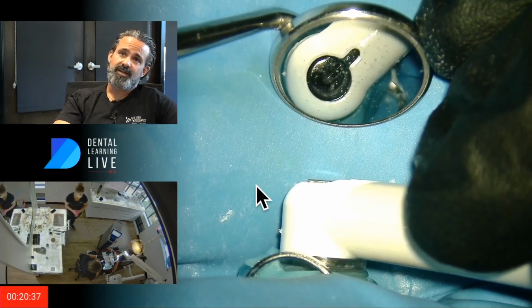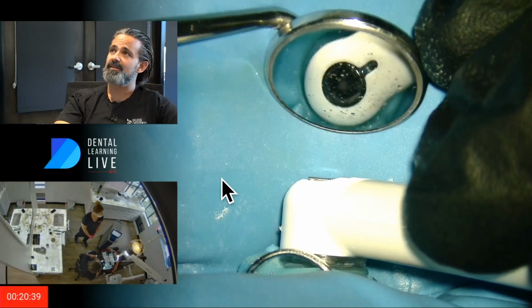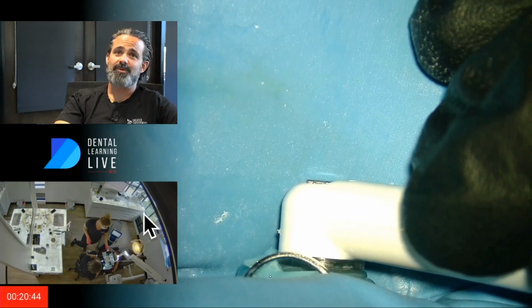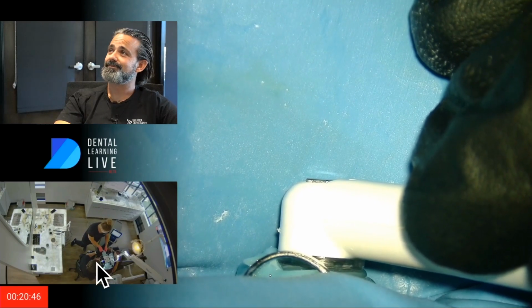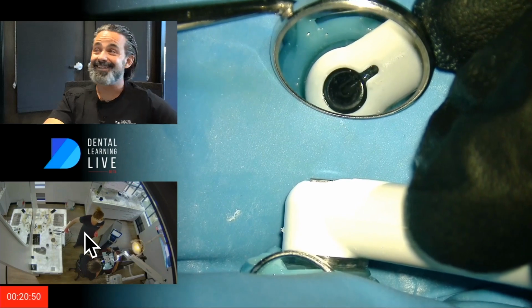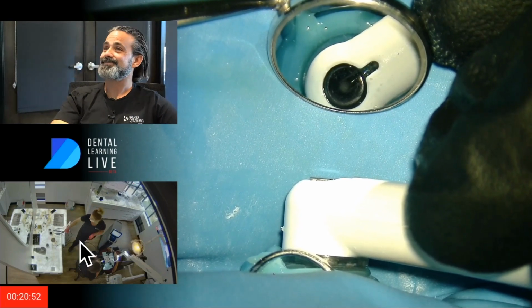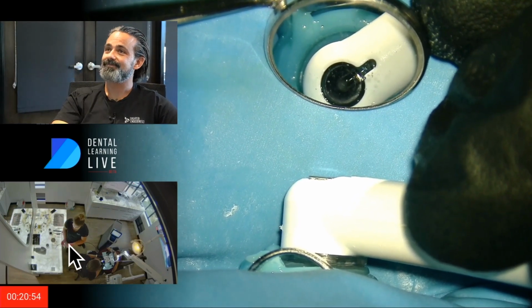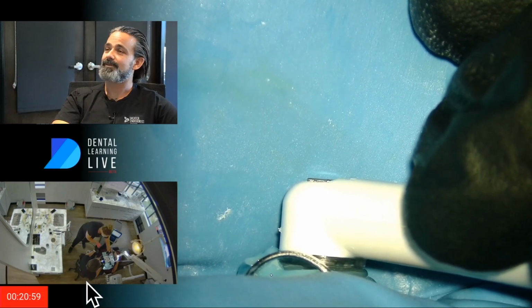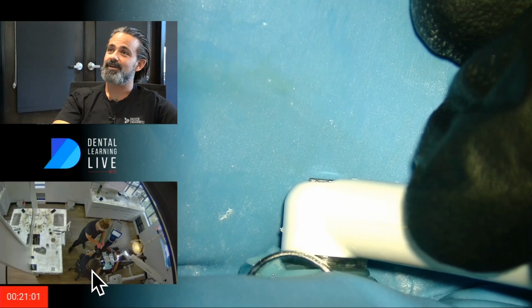And then the trade-off is that's when the assistant's doing the notes, because they have nothing better to do unless I want them to suction a little bit or wipe that mirror. See, she heard me. She wiped right then.